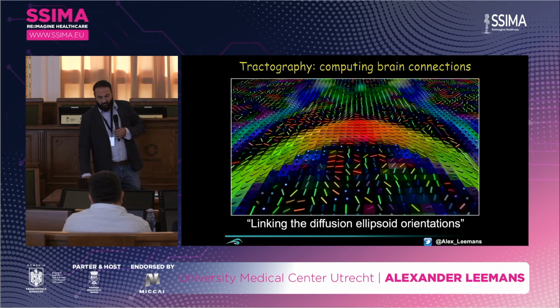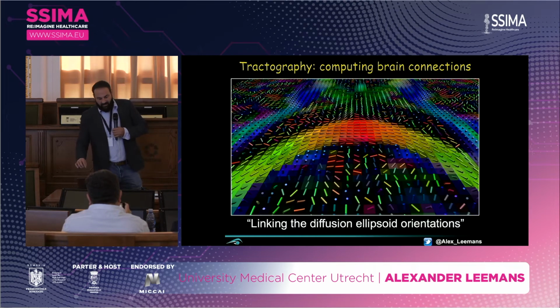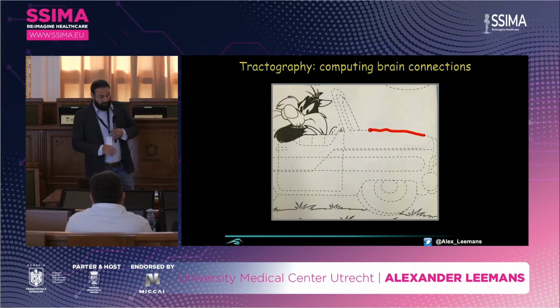So we're basically looking at the main orientation of this ellipsoid, and then we're connecting these discrete elements. And in a way, it's similar like this, right? If I ask my kids, just connect these little lines, they can do this easily, right? They just connect these discrete elements. And, in science, we can do the same. We can do vector field interpolations, Runge-Kutta interpolation, and get something similar.